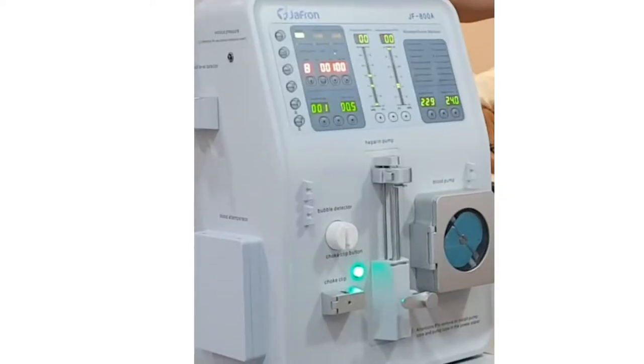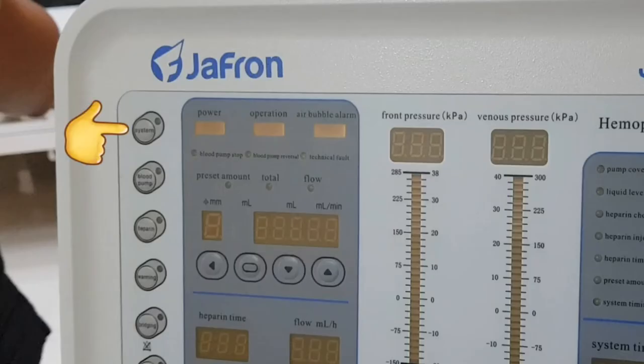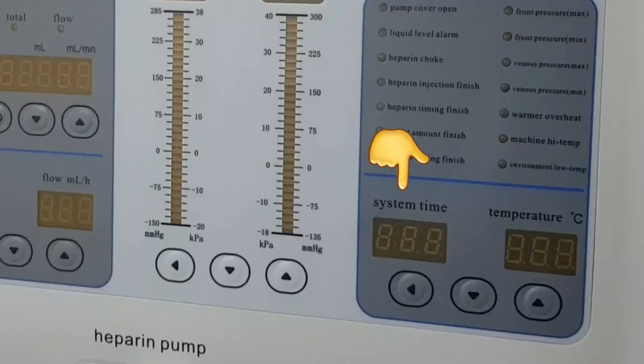Hemoperfusion machine parts: the power button is at the back. Once switched on, the power light turns on at the front. The system button signals the start of treatment, which will automatically be activated after bridging. You can manually press it too, but if there is no blood yet it will alarm. The system time can be set using the left arrow button to switch to a particular digit place, then the up and down buttons to change it.